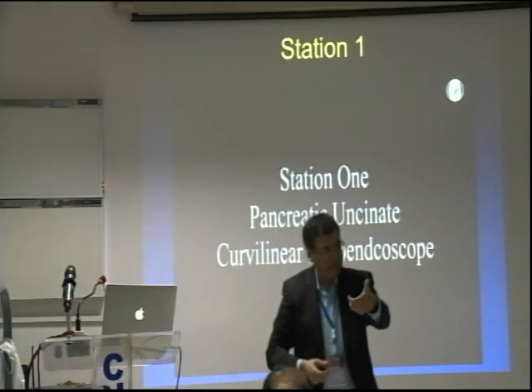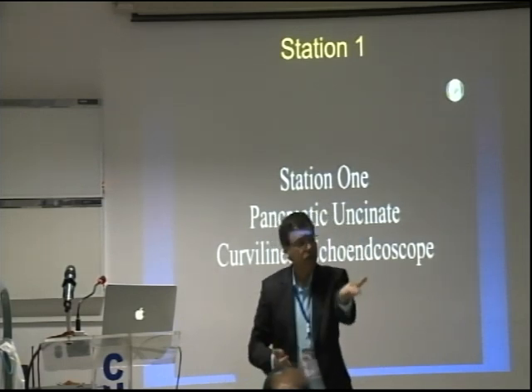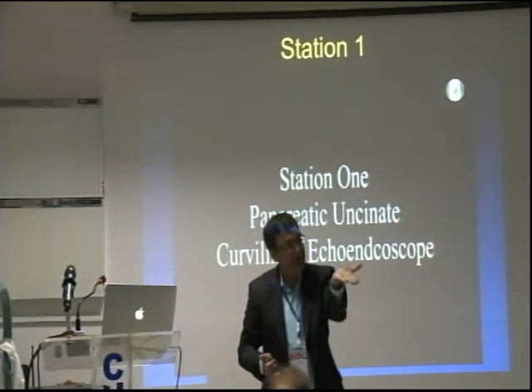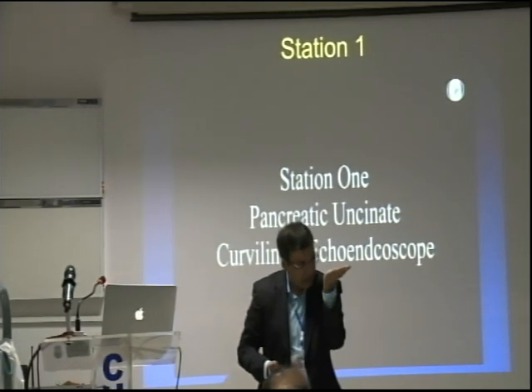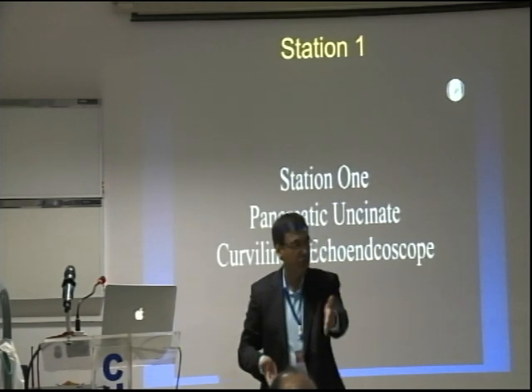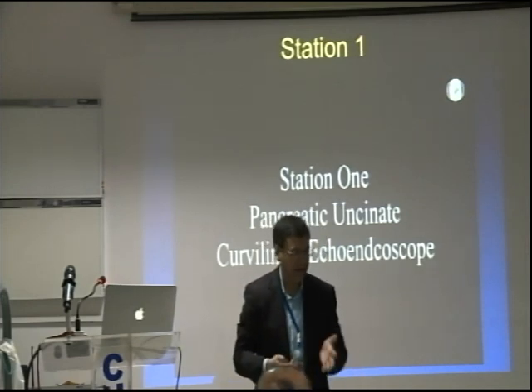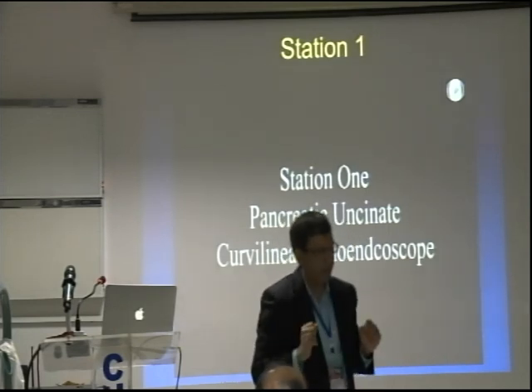So when you do the big wheel towards you, you're trying to take a look at the ampulla. You're never at the ampulla by EUS. Endoscopically, you may feel like you are there, but you're always 1 centimeter distant. That's station 1. From there we come to station 2, and then station 3 is actually a little bit of the bulb area. So that's one way, endoscopic.